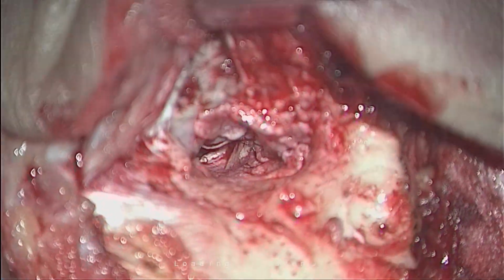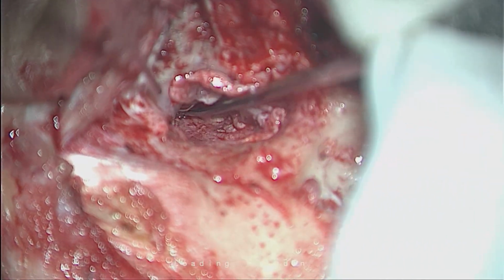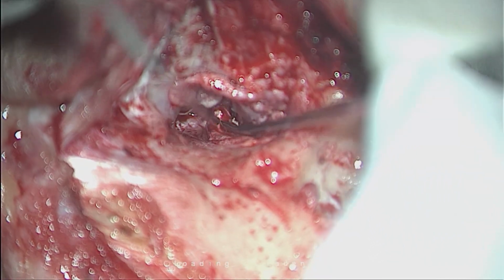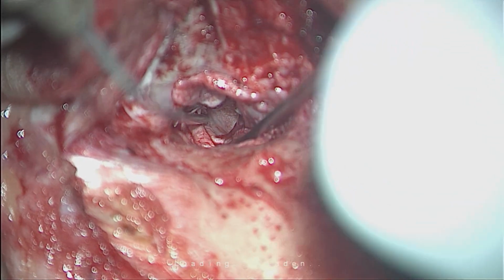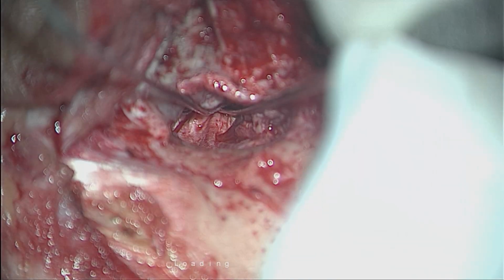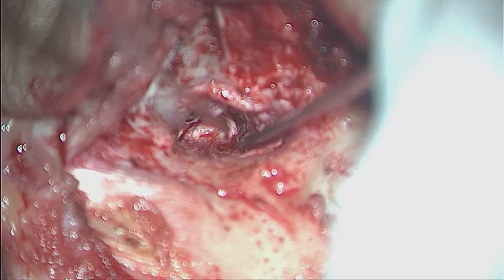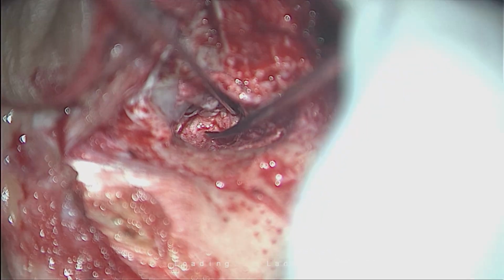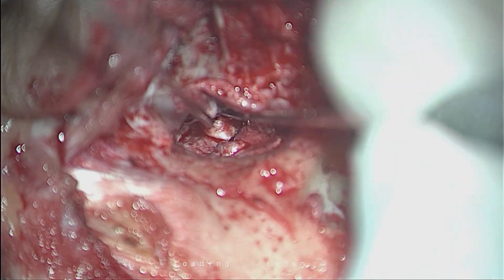I mentioned in the beginning, the surgery I am doing is one which I learned in the 90s from ABR Desai. See this fresh graft, boss. Yeah, man. So my grafting is in 3 phases. The first phase is over now. What I have done is introduction of the graft in the middle ear. Can you see? Yeah. Pushed it far anteriorly.